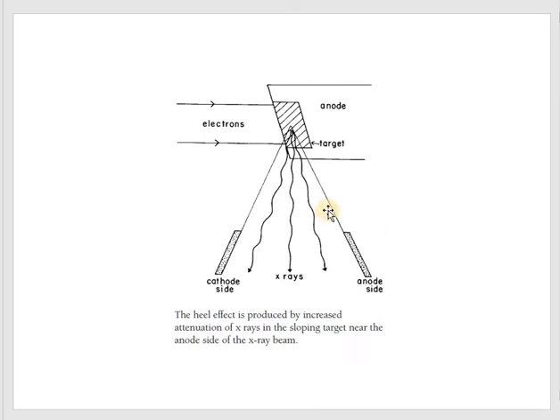So that is one of the reasons why the intensity is much lower at the anode side. The second reason is that when the X-ray is produced within the anode target, say at the same position, it depends on the direction of the emission. If the emission is directed towards the cathode side, it needs to penetrate just a small length of travel path within the anode.